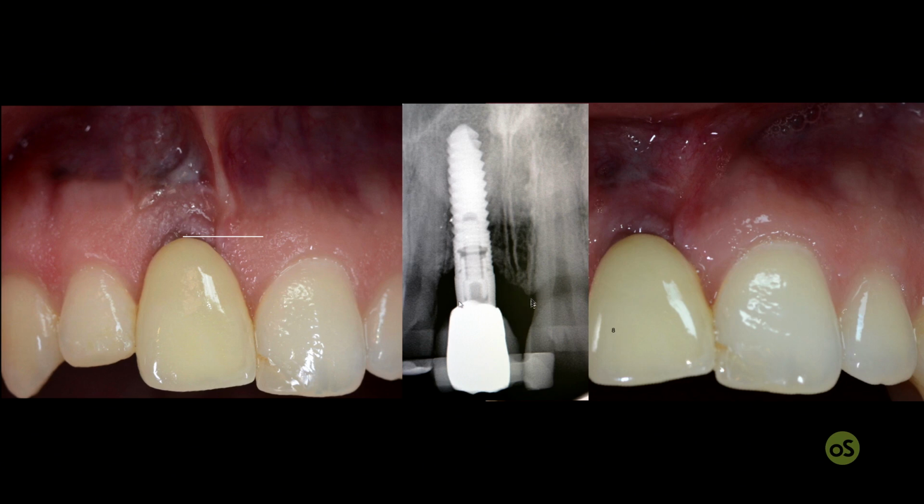Obviously, the area here, you can see black, mesial and distal, which correspond to the area of the papilla, is not supported by bone as it is in the presence of the natural dentition, where the bone is intact. And this is very important because now we are going to speak about the papilla area. And when we speak about the papilla area around this crown, we have to consider that the bone underneath is not completely intact.